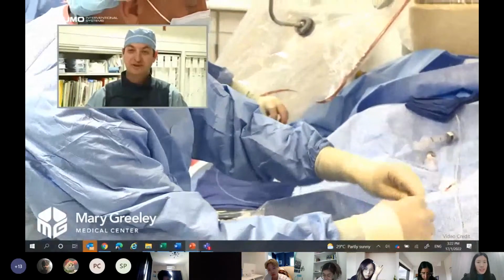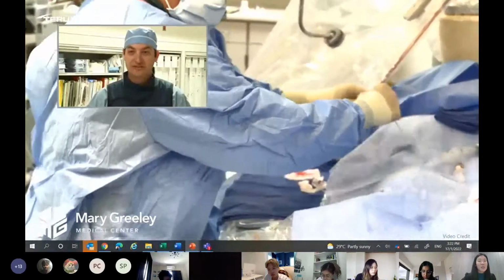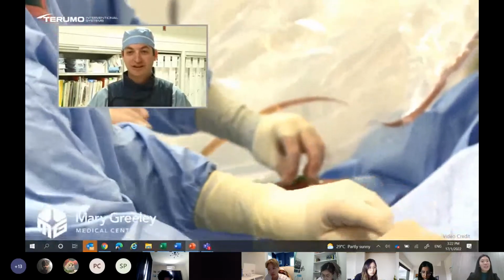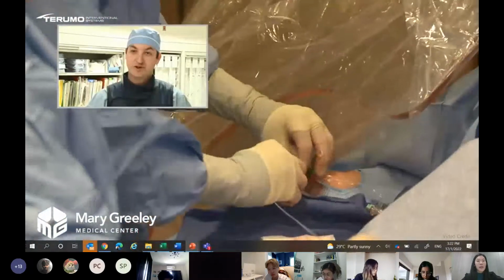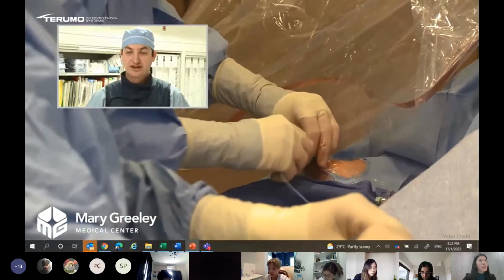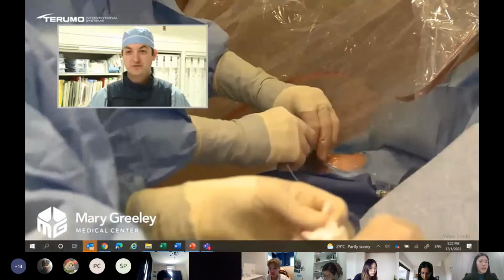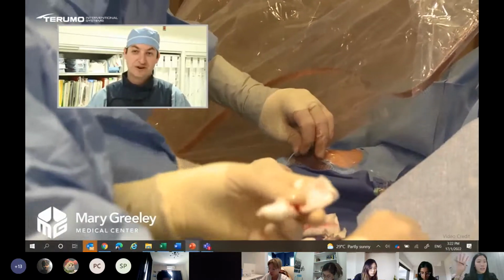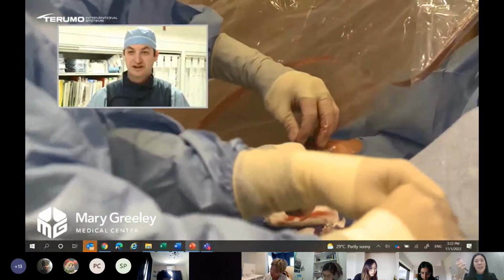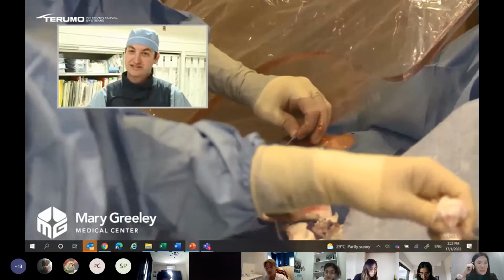So he will pass the tip of this diagnostic catheter, because there's actually the guide wire in already. So he's not assembling, he's actually just backloading this second diagnostic catheter into the existing 035 guide wire. So he gives it to the first operator, who advances it into the ascending aorta again. And again, if the diagnostic catheter is already in the ascending aorta, I don't need the wire to guide my catheter anymore, so they will pull out the guide wire.